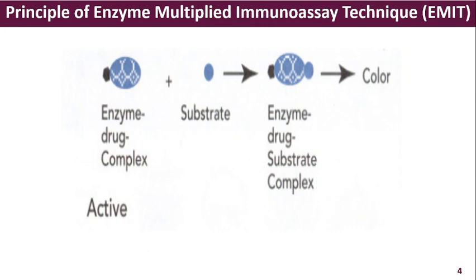So the para-nitrophenol phosphate, when it is reacted upon by the alkaline phosphatase enzyme, it will give rise to yellow color because of release of the phosphate molecule from the para-nitrophenol phosphate, which is in short form called PNPP. When the para-nitrophenol phosphate is conjugated or bonded with phosphate molecule, it is colorless. But on reacting with alkaline phosphatase enzyme, due to release of phosphate, it produces yellow color.